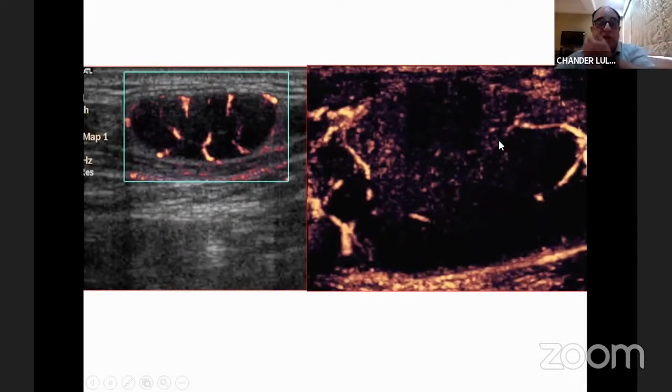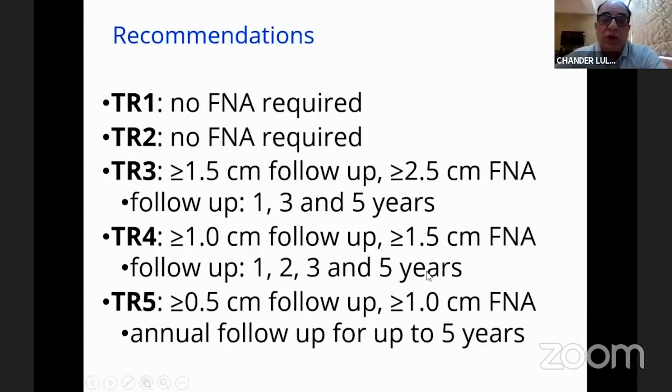or even sometimes calcification, then these are suspect. The hilar echo is usually lost. They can be hypoechoic, they can be globular, and then we would need to biopsy them. And this is the size criteria. I have already spoken to you earlier, and the recommendations about the same.